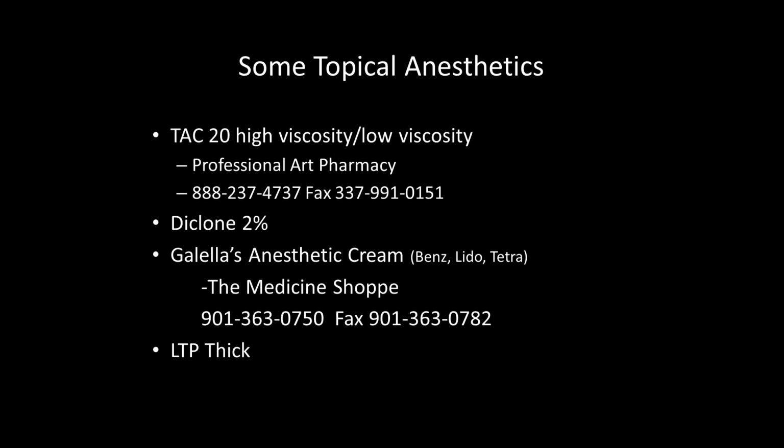So it's a white pasty gel, and if you leave that on dry tissue for about a minute, it's an unbelievable numbness that they get, and you can easily recontour up to about 2 millimeters of soft tissue without the patient feeling a thing when they use that. Another one is called LTP Thick. So all of these work really, really well. They just have to be applied and set on dry tissue, typically for a minimum of a minute.